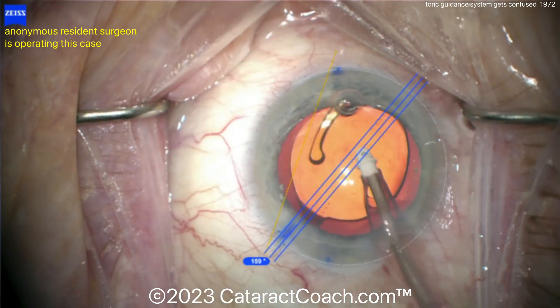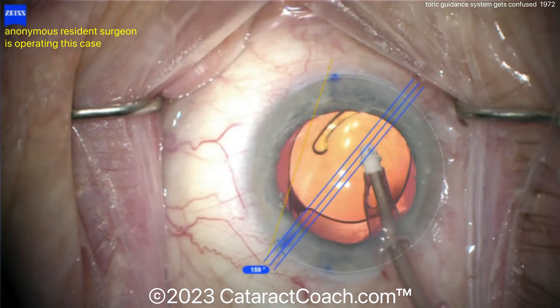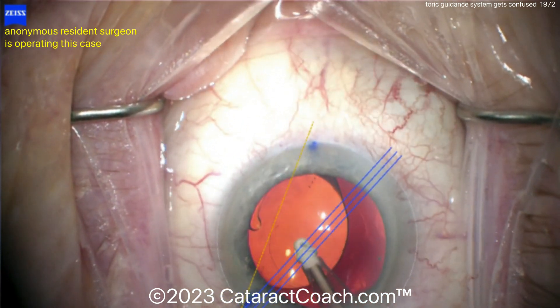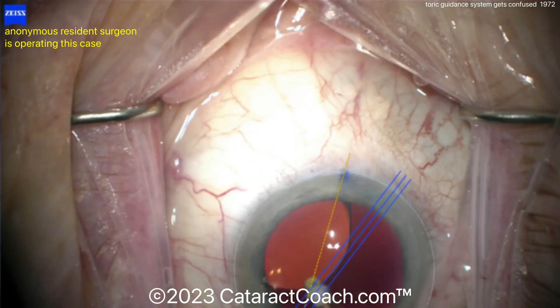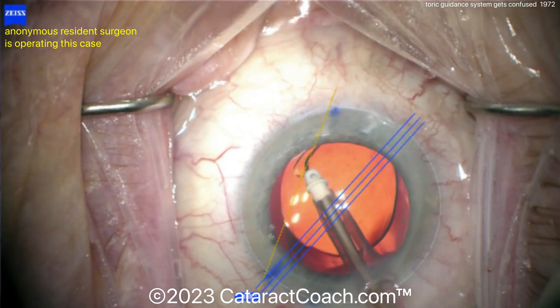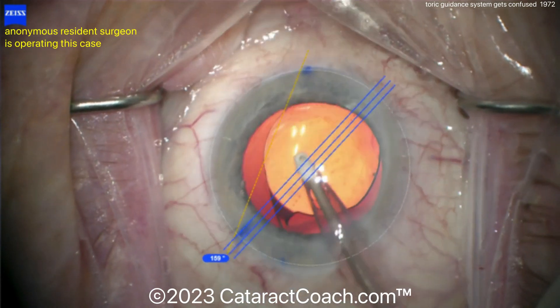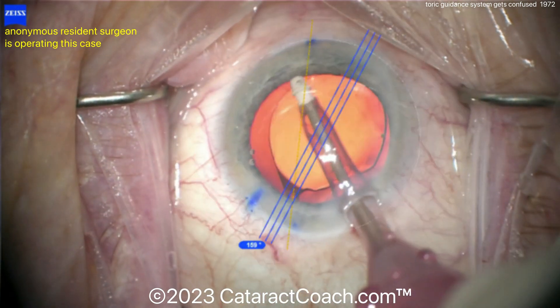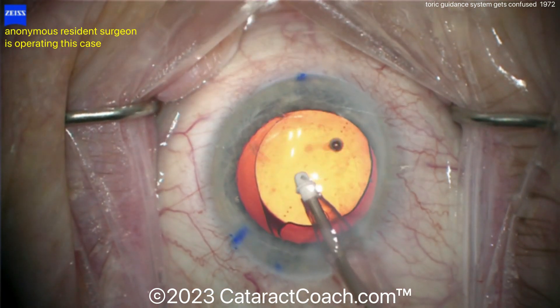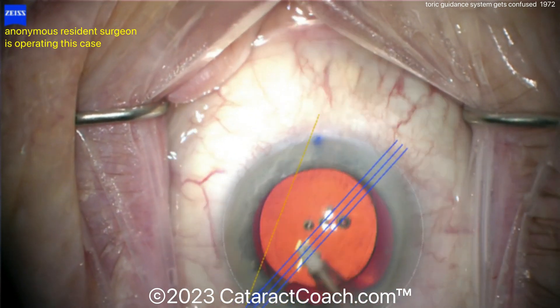What is actually what? The machine alternates back and forth between the two. You'll need to just cover up with a sponge or something — block the ink mark from the paracentesis in order to get this lens guidance system back on track. Good job removing the viscoelastic, but even with the guidance system, I think your purple ink marks were not 180 apart, so I question whether or not this is going to be accurate at all. You can see how the machine just keeps getting confused and doesn't know which one to use as the 180 mark — whether it's the paracentesis ink mark or the other ink mark at the bottom of the screen.